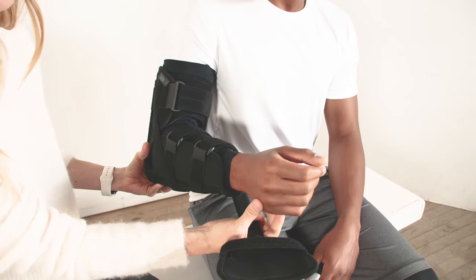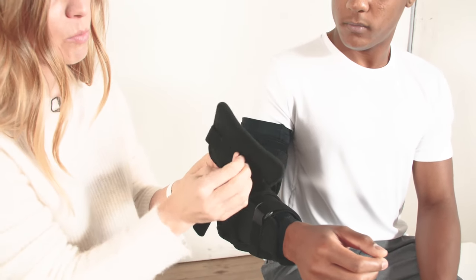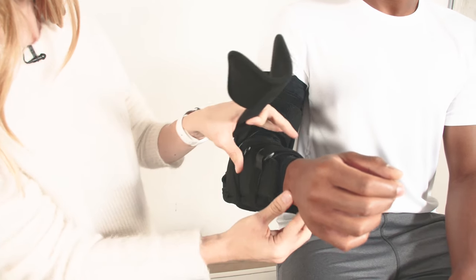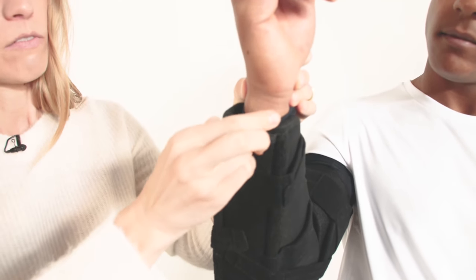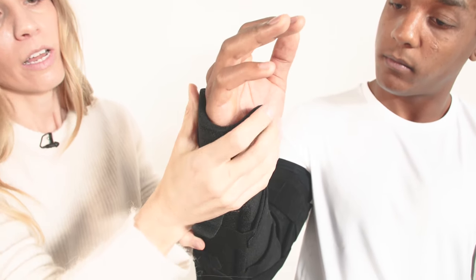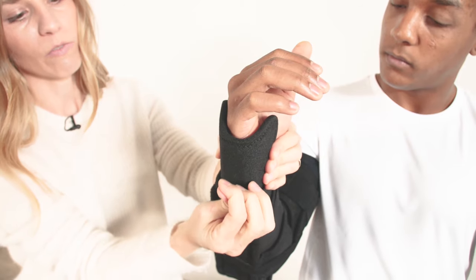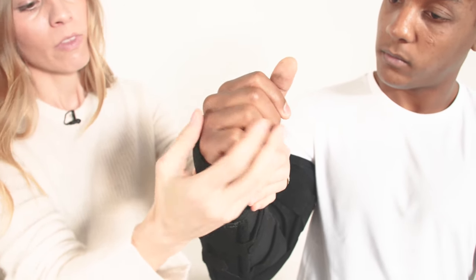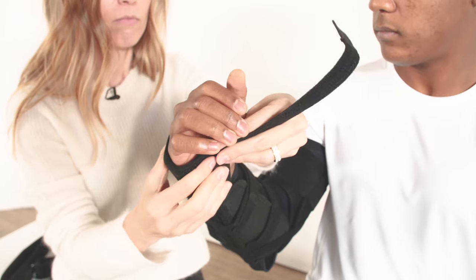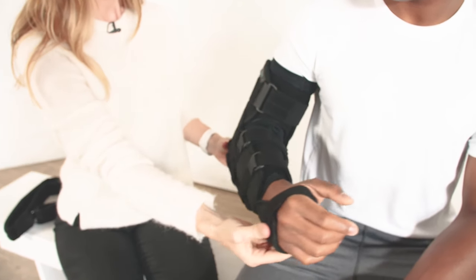If I wanted to include the wrist to prevent any pronation or supination and to give that wrist support and stabilization, I'd use the wrist component piece. I'm going to remove the strap here and bend this into a cuff so that it'll capture his hand and be comfortable. Under here you'll see a little velcro tab which opens up a slot for the stay to slip into. I can adjust that for length so that it's a perfect fit. My goal is to stay below the MP joints so that he has full finger flexion and extension. Once that's in place I just add the hand strap, and that completes closure with the hand accessory in place.